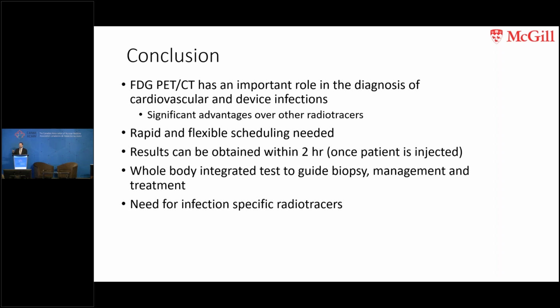You don't need to spend 1 or 2 days in hospital, taking a bed, waiting for a diagnostic test. It's a whole body test. We can guide biopsy management, treatment, and stage the entire infectious disease picture. And if we can get some infection-specific radio tracers that are available, cheap, and easy to use, then in certain specific settings, it should definitely have an important role to play.